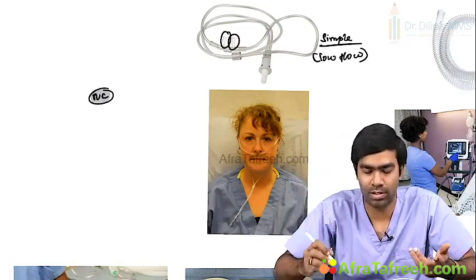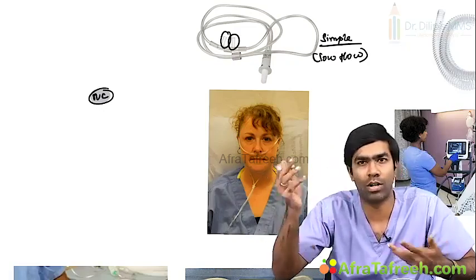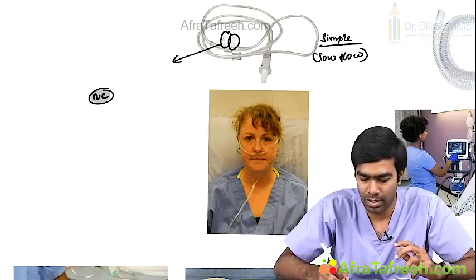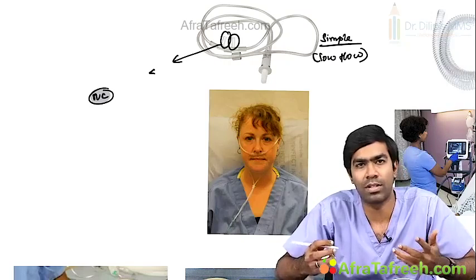So for nasal cannula, we have 2 types. One is called a simple nasal cannula. This is an example of a simple nasal cannula, otherwise referred to as a low flow nasal cannula, where there are no complex arrangements, you just connect to the oxygen source and put it into the patient's nose. That's it, nasal prongs. And very importantly, whatever the cannula, whether low flow or high flow, the prong size should be less than half of the diameter of the nostril.